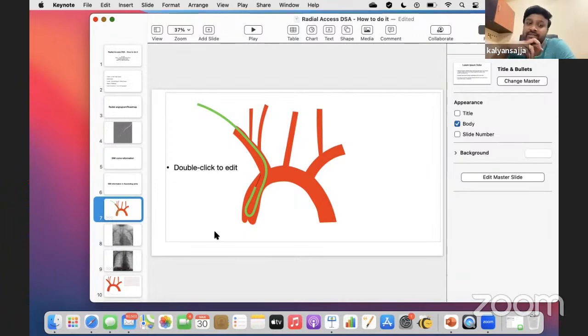The bigger interventions might not be extremely possible, but then I use the SIM 6 French guides, and that will just stay hooked up or anchored in the origin of the common. So you can take an intermediate catheter like the Fubuki 043 through that, and then use a microcatheter.